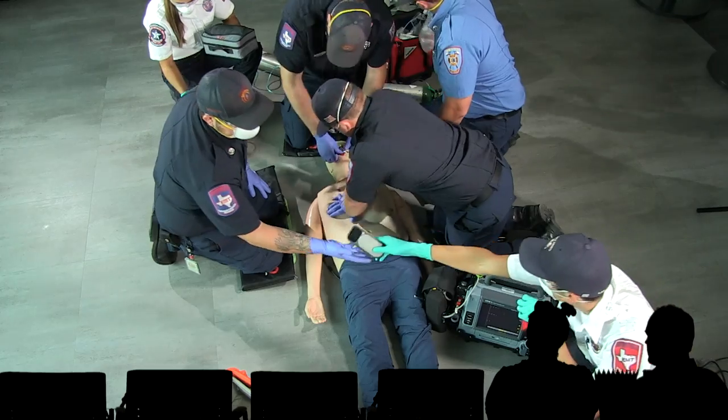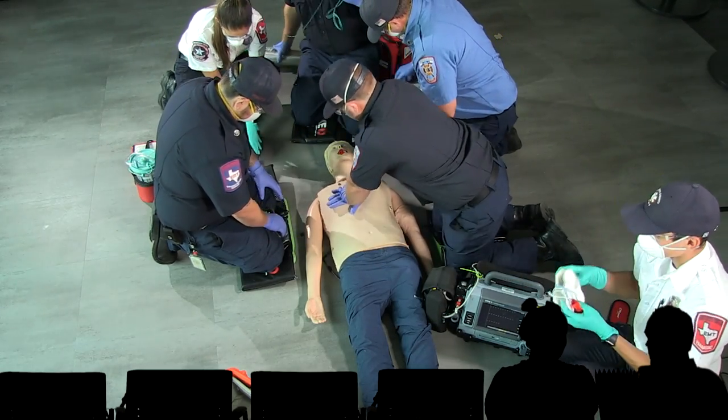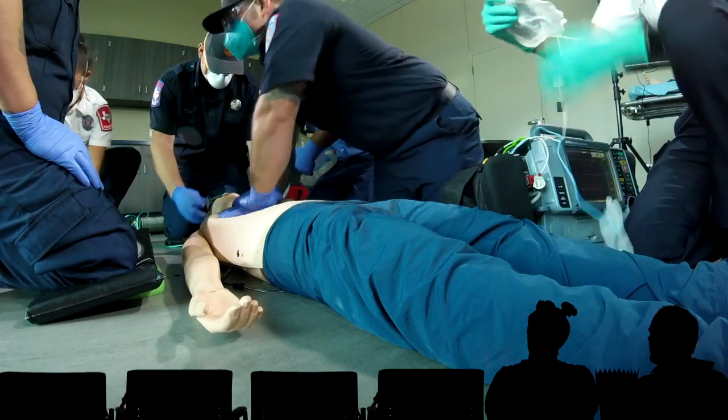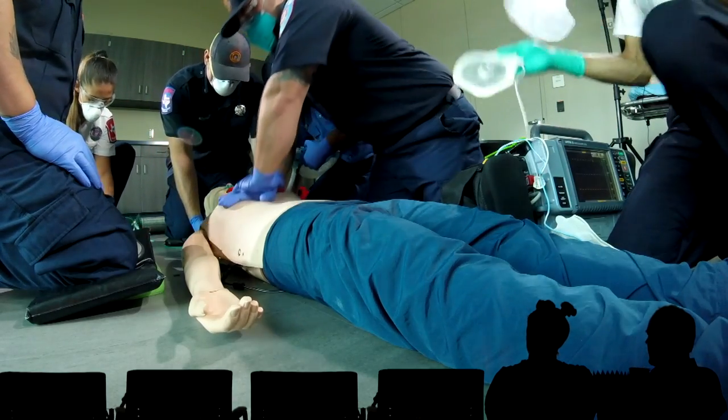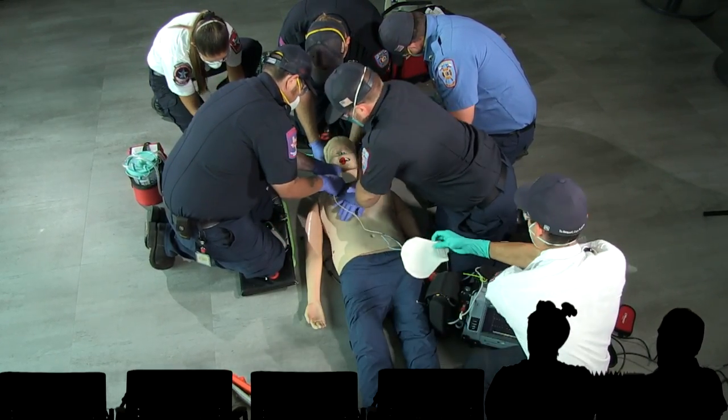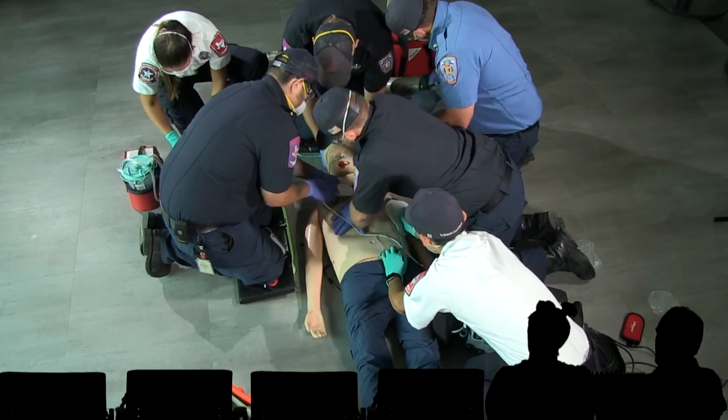No. Mi nombre es no Annie en Español. Oh, see. There you go. Thank you. That looks like an Edward. Yeah, it does look like an Edward. He's not doing very well. But man, we're doing good compressions here. I'm liking that. There go the defibrillator pads.